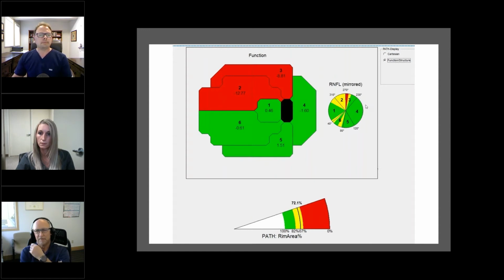Yeah, sure. Do you have sort of a theory then? I mean, if you look at this and then you're having them come back for the OCT a month later, do you kind of have this as a little bit of a preview of what you think might show up on the OCT? Well, it does function that way in clinic. I'm having to be efficient because I've just added a couple minutes to my schedule.